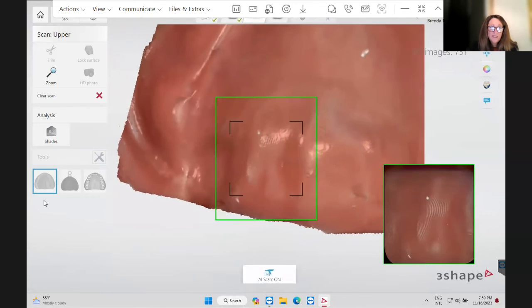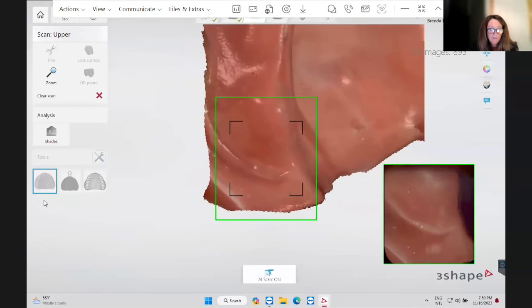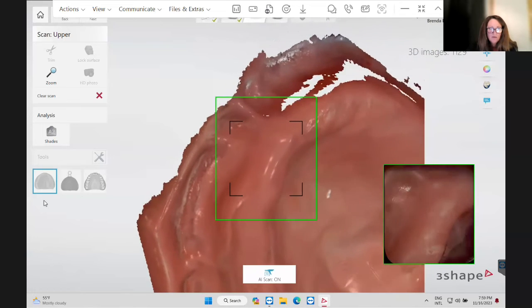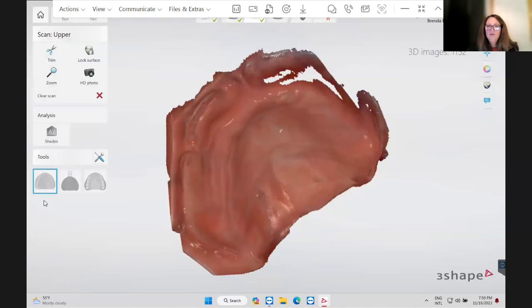sometimes they don't have those landmarks that a scanner will need, which are lumps and bumps. So sometimes I'll even take flowable or liquid dam and do that same mark. I call it a wavy snake on there and cure it. Because at the lab, we're not going to make this like a hole. So with their mesh mixer, they'll smooth it off. And the same thing on the side of the denture where their tongue rests, they'll smooth that. They know that the patient does not have this little snaky wavy thing on their existing denture.